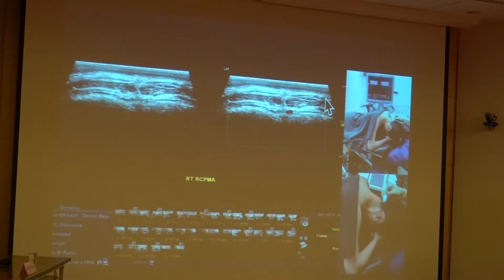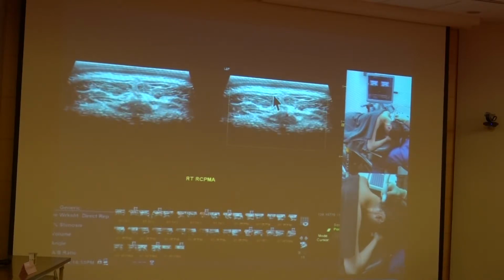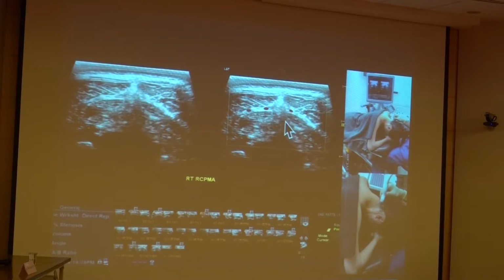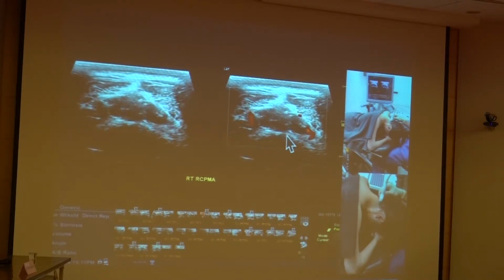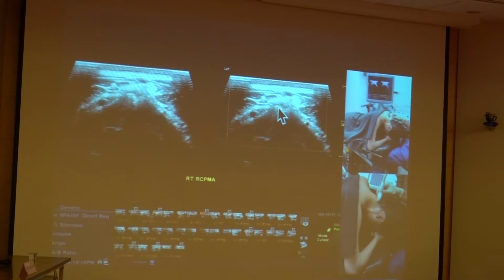This is more medial. Now I'm scanning from the middle, reading on the midline, upper trapezius, a very thin layer. You see the semispinalis capitis, two bundles, medial bundle and lateral bundle, rectus capitis posterior major, and you see the rectus capitis posterior minor, and then when you're seeing the C2 spinous process, the bifid spinous process, you see the posterior arch of the C1, and you see the C2, the bifid spinous process on the midline. Let's do that one more time.